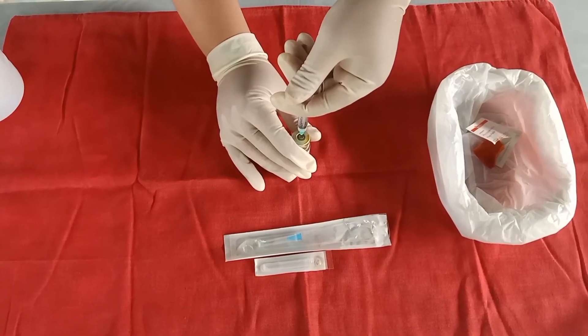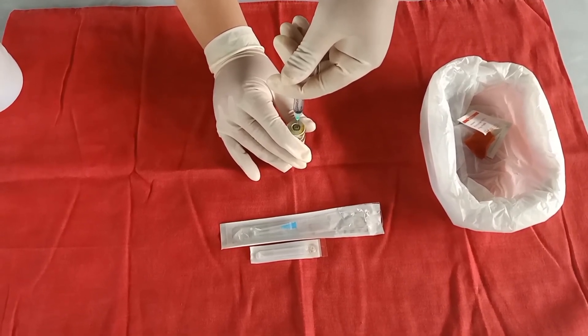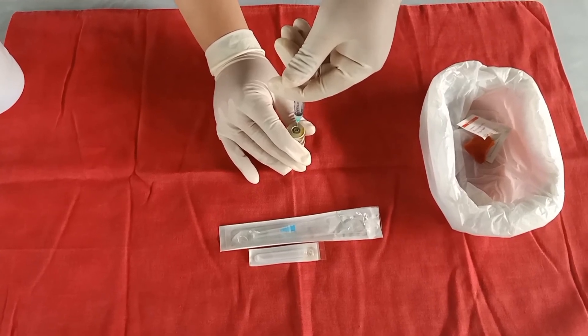Withdraw the prescribed amount of medication by inverting the vial. Ensure the needle tip is below the fluid level, and gradually withdraw the medication.